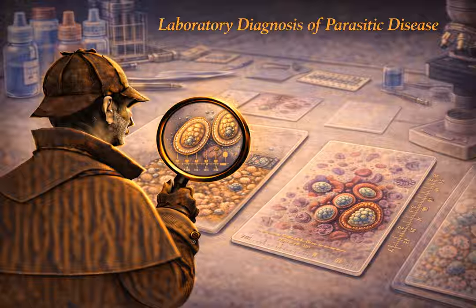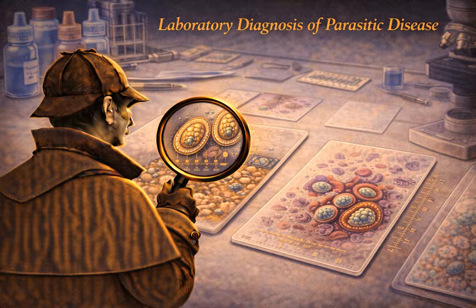How does making it thicker increase the sensitivity? You take a very large, fat drop of whole blood, put it on the slide, and use the corner of another slide to stir it around to defibrinate it so it doesn't clot. You let it air dry completely. Then, during the staining process, you use water. That water osmotically lyses. It literally explodes every single red blood cell on the slide. So all the red cells are just gone. Gone, washed away.